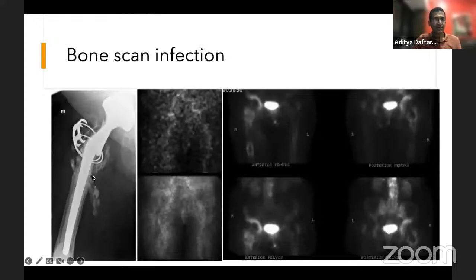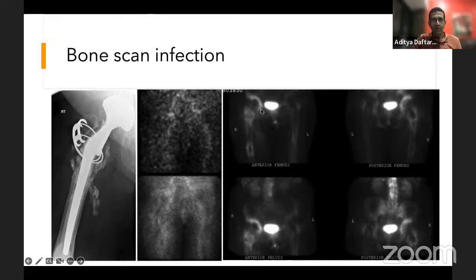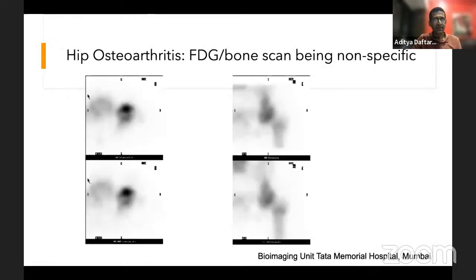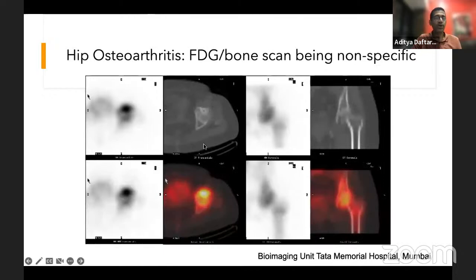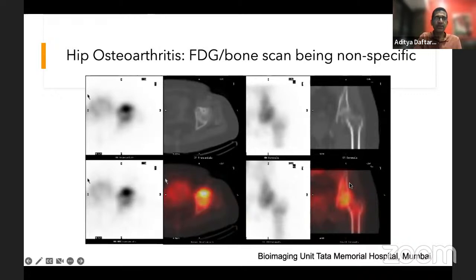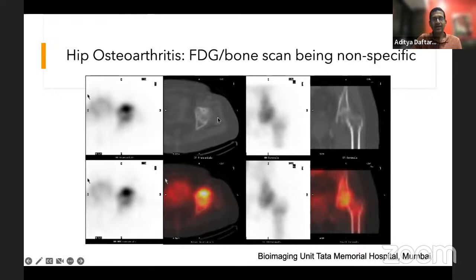Here's how we used to look at infection in the past. An X-ray shows destructive bone, a bone scan shows increased uptake on the arterial phase, blood pool, and delayed images — uptake along the acetabular cup and femoral stem — typically interpreted as infected prosthesis. Here's another example with a fluorodeoxyglucose scan: intense uptake in the femoral head suggests osteomyelitis, but the CT shows subchondral cystic change — this is actually nothing more than an acute exacerbation of osteoarthritis producing intense uptake.